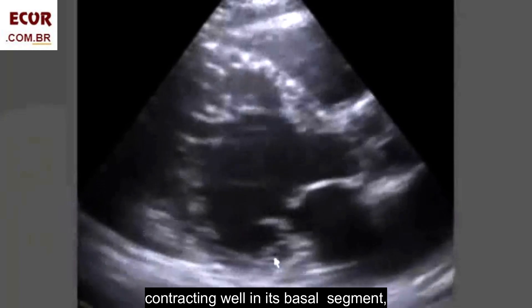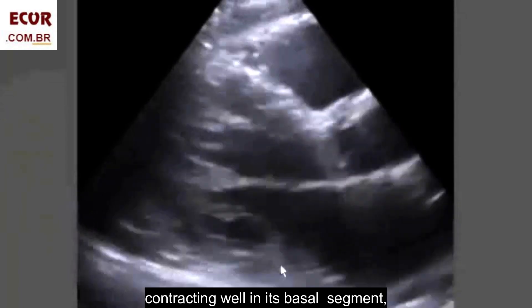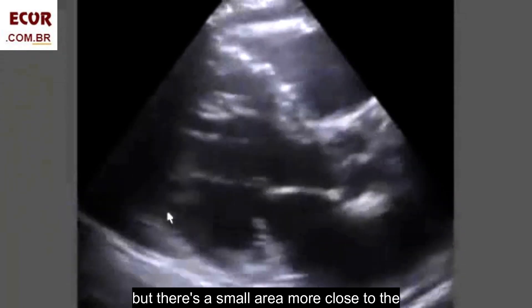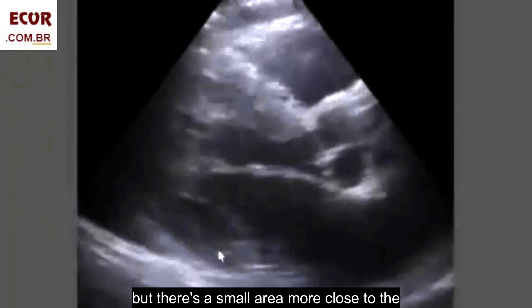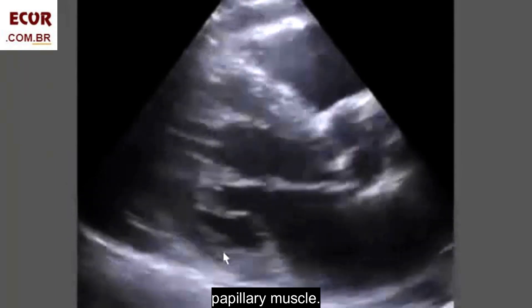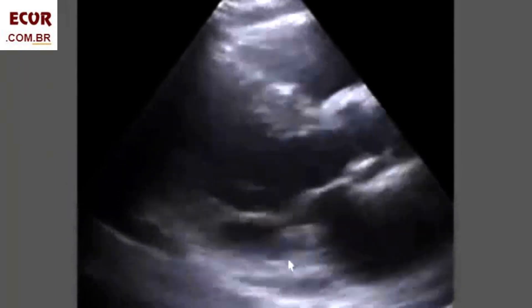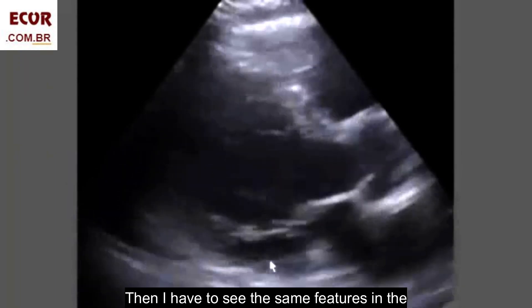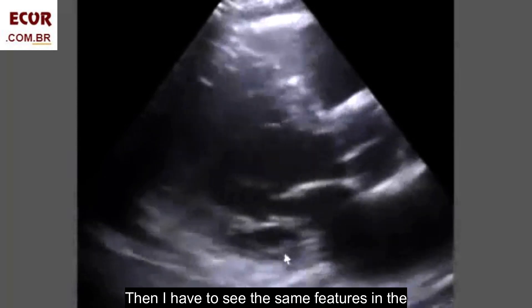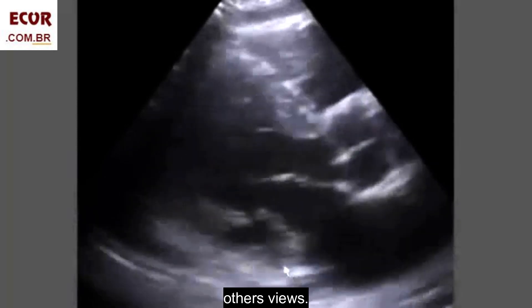It seems to be contracting well in its basal segment, but this small area more close to the papillary muscle does not look normal. Then I have to see the same features in the other views.